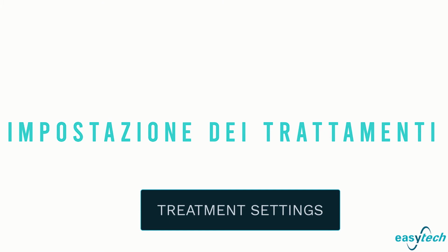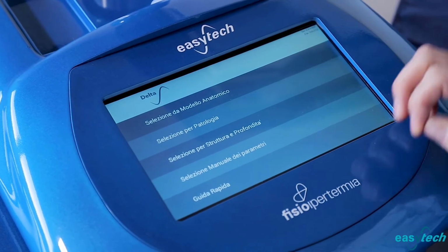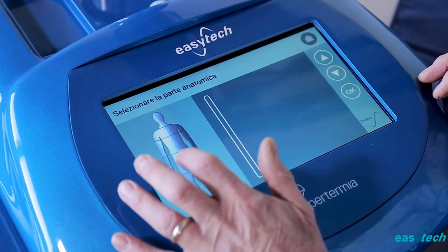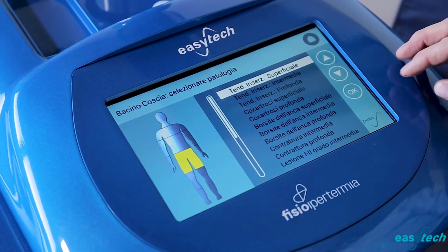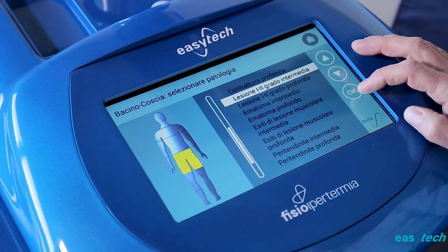There are 4 ways to set the device before starting a treatment. First, select the anatomical district you want to treat. Then choose from a list of pathologies that will appear on the display. Press OK to start the treatment.